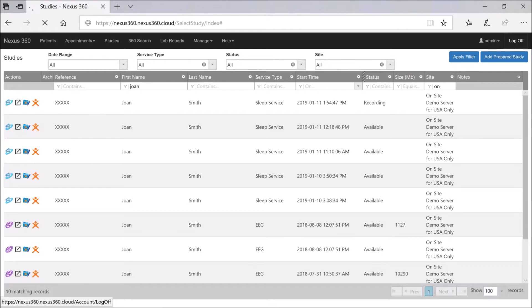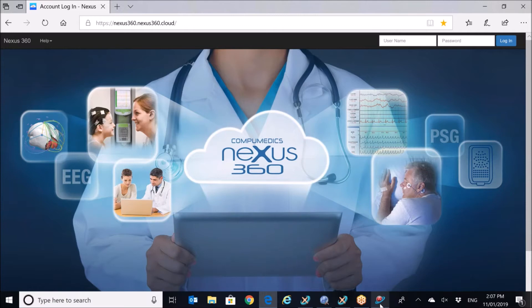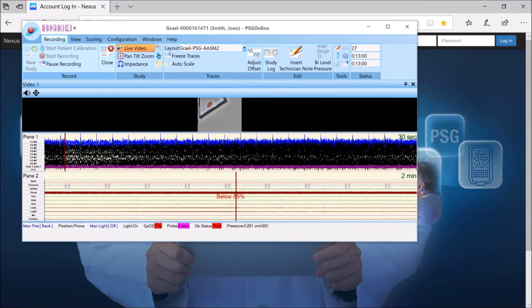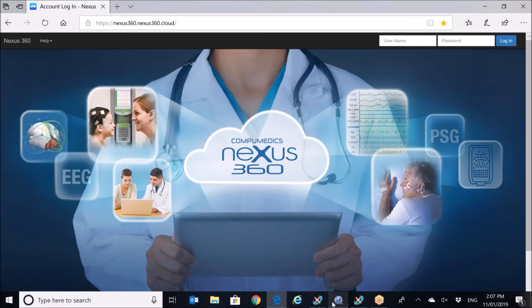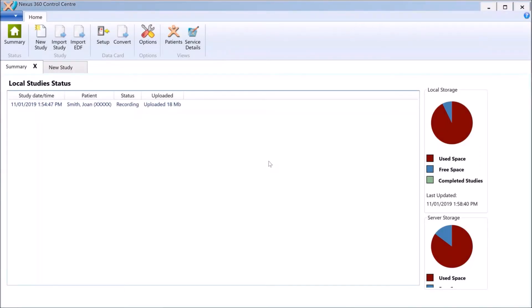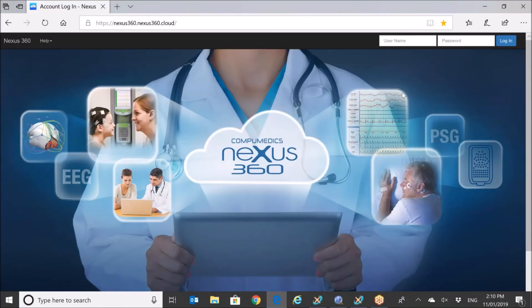I'll close this down and log out of Nexus 360, then go back into PSG Online and stop the recording. Going back into the Nexus 360 Control Center — now that I've stopped the recording, it will upload the remainder of the study. We'll wait for that to finish, which may take about a minute. Now we can see the full study has been uploaded and it's 23 megabytes in file size.